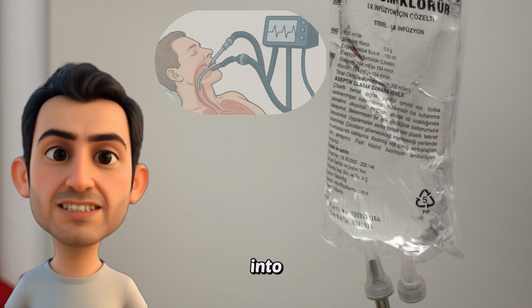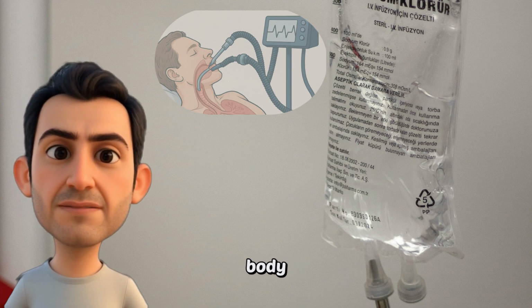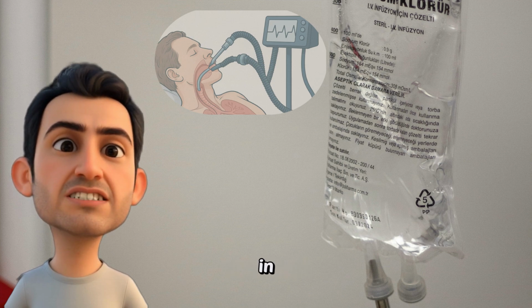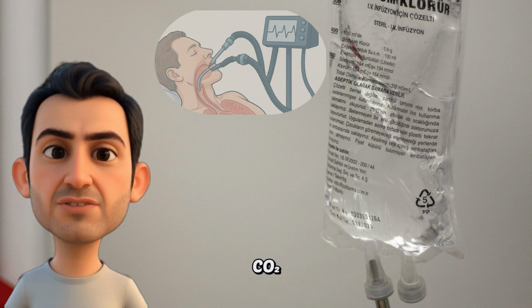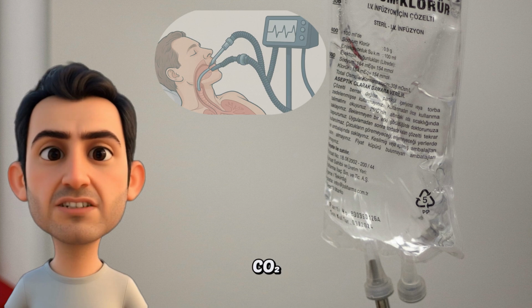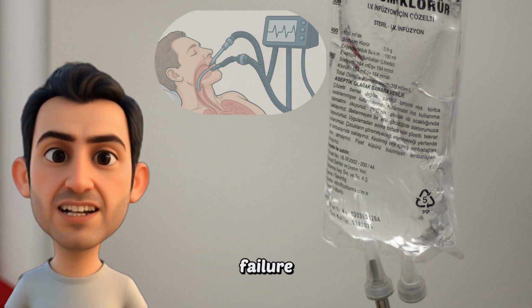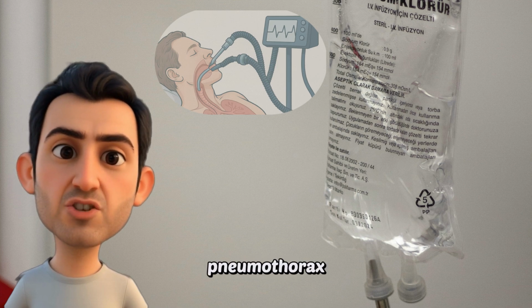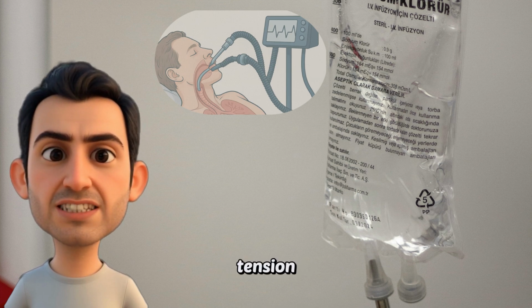But here's where people get into trouble. Not because they intubated, but because they forgot how the body might respond to positive pressure. For example, if someone's in severe metabolic acidosis, like in DKA, they're blowing off CO2 as fast as they can. You put them on a vent with a fixed rate, you might trap CO2 and crash their pH. Same with someone who's hypovolemic or in right heart failure. Positive pressure drops preload, and suddenly they code. And if there's a pneumothorax, you better decompress first, or the vent will turn it into a tension pneumo.